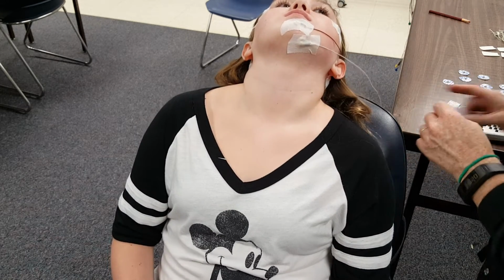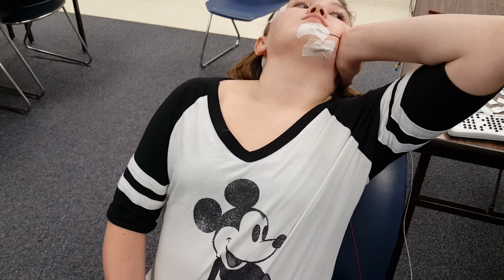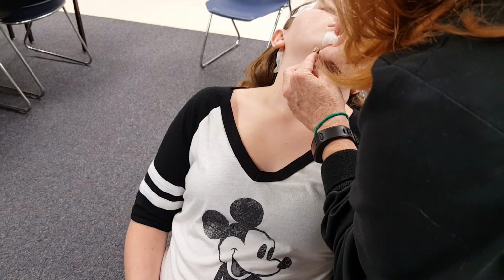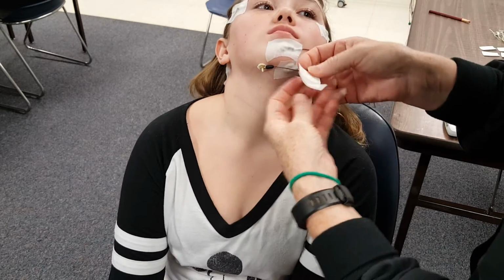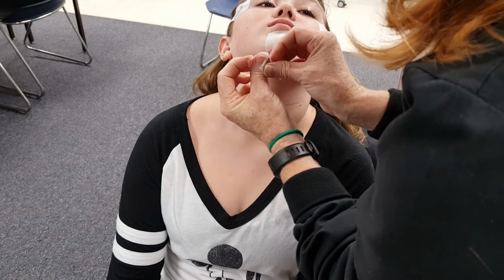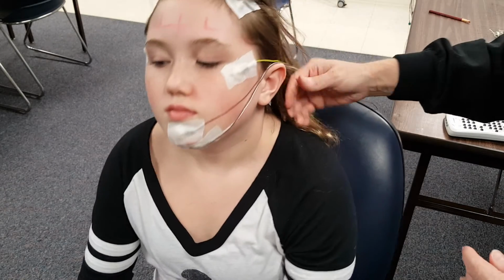Again, this one I will tuck behind that ear. Now your next chin electrode, you could go either way. You could go over the other ear, or you could angle it on this side as well. And I am going to stay with the same side. Oh, keep your head back, please. All right, sit up. There we go.